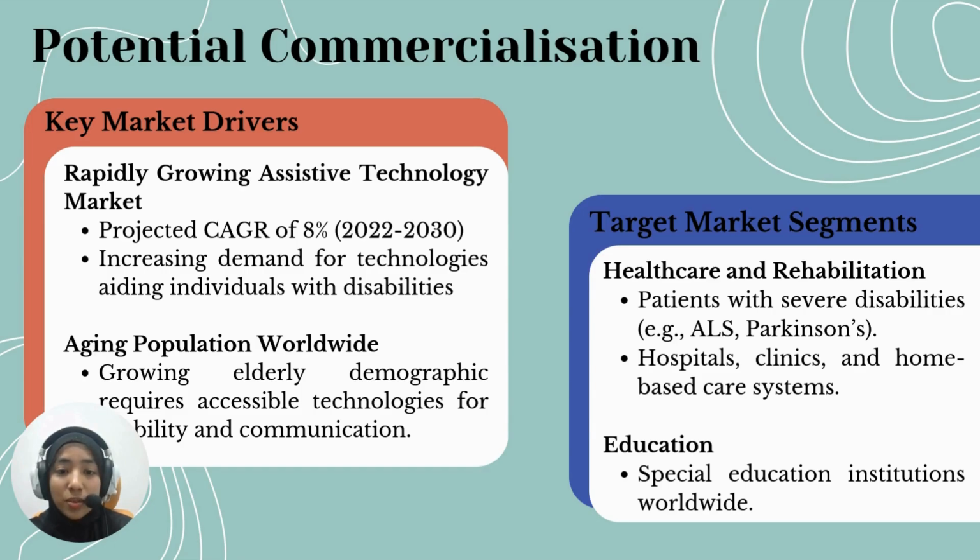It caters to hospitals, clinics, and home-based care systems, providing essential support for communication and independence. In the education sector, the solution addresses the needs of special education institutions worldwide, offering accessible communication tools for students with unique requirements. These targeted segments ensure OptiCom delivers impactful benefits to those who need it.